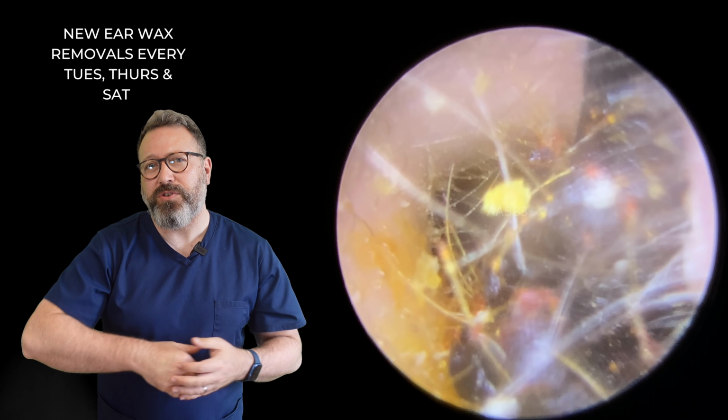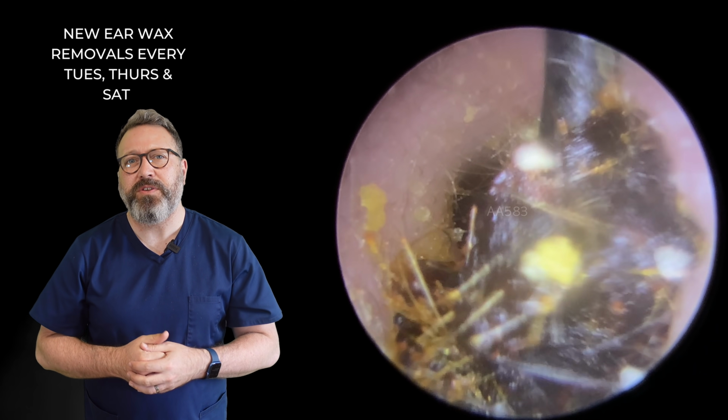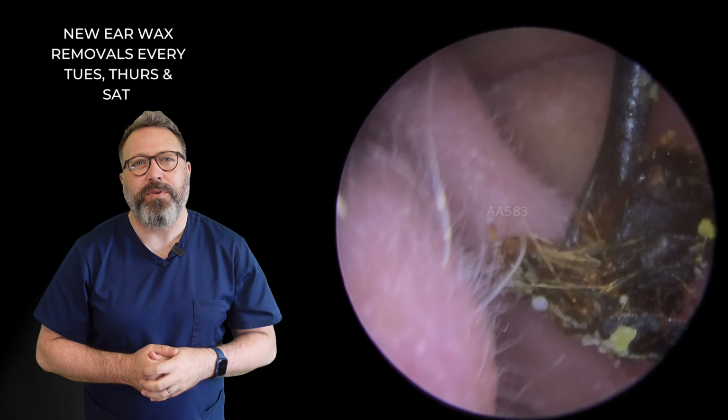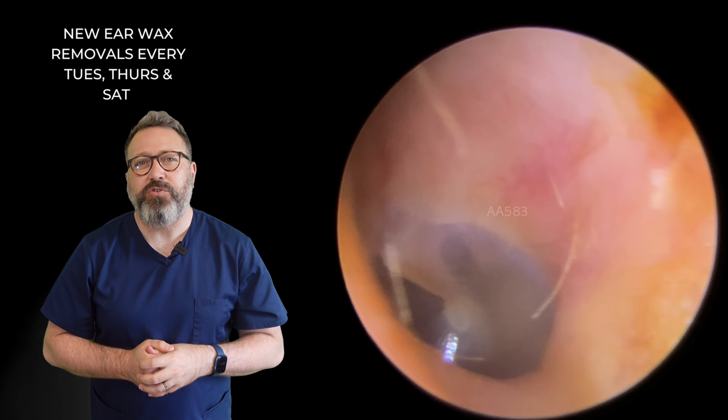So we're just going to cut across on the one side now. That scooping motion, so pulling forwards and around the side, trying to keep all of this ball of wax together here. There we go. And out that comes. You can see a little bits of dry skin underneath as well. Eardrum on that side looking lovely.